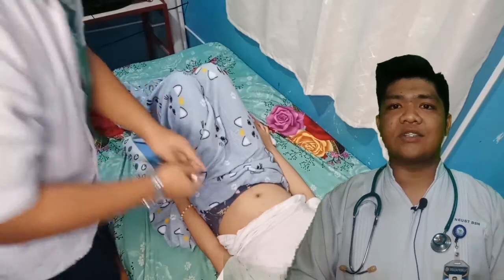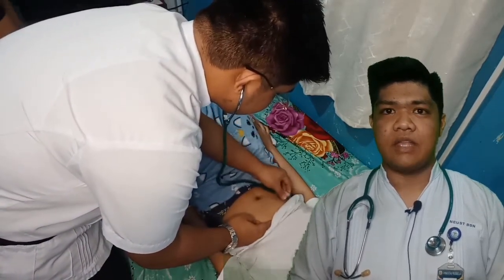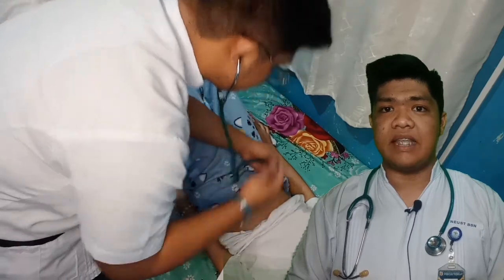And now, we auscultate the fetal heart rate of the baby. Feel and hear the heart rate of the baby. Take note, the normal heart rate of the baby is 120 to 160 beats per minute.